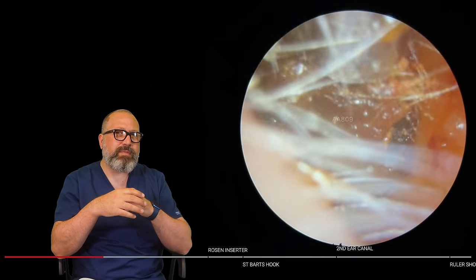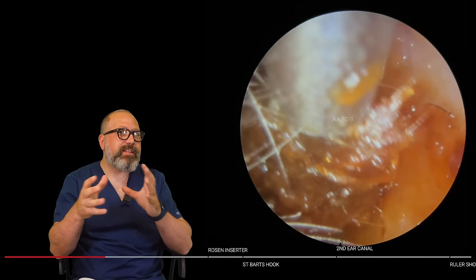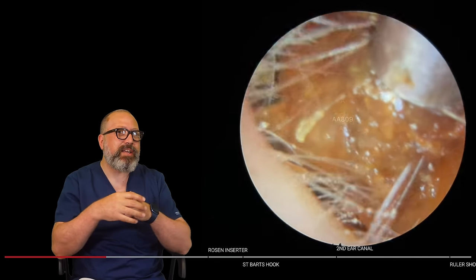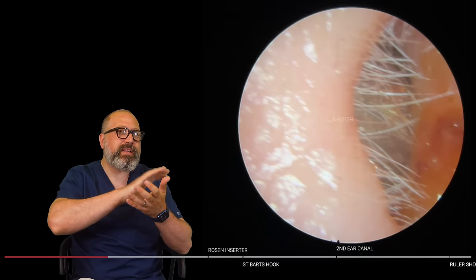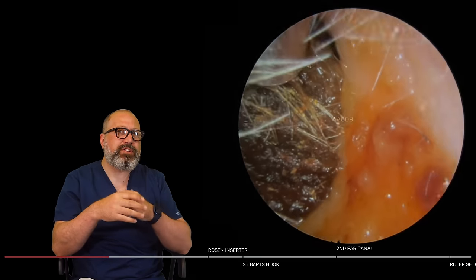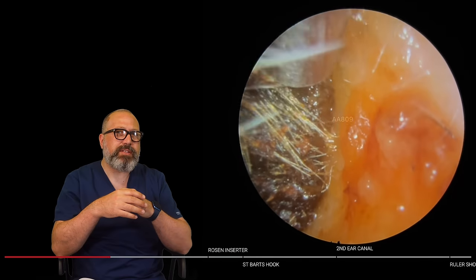A bit more of a wiggle, there we go. We're starting to get a bit of movement. Now we're starting to see a piece, but I think this is that front section detaching from the plug beyond. Yeah, it just looks like it took that whole front section away there. So we've still got this quite large, chunky piece sitting behind.